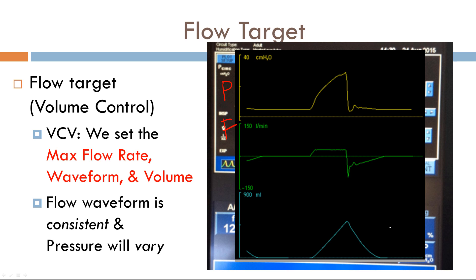Here's a quick quiz. Take a look at these waveforms: pressure, flow, and volume. Pause and let me know what the target variable is and what the mode of ventilation is. Taking a look at this, let's go through each scalar individually. I take my eyes and look at the flow scalar first — if it looks like something I have set, that has to be your independent variable and therefore your target variable. This is a very nice constant ramp shape, and there's no way that is a dependent variable — this has to be the independent variable.